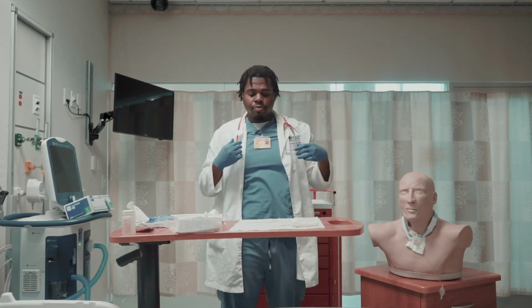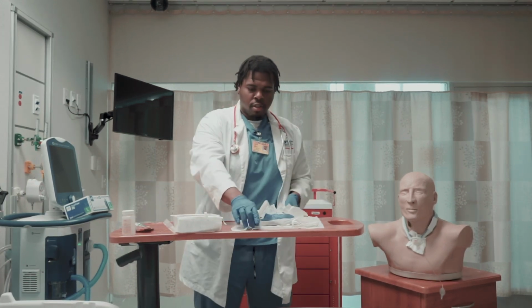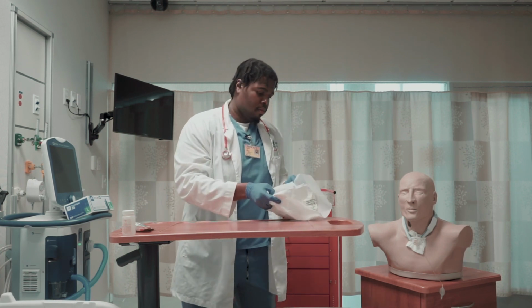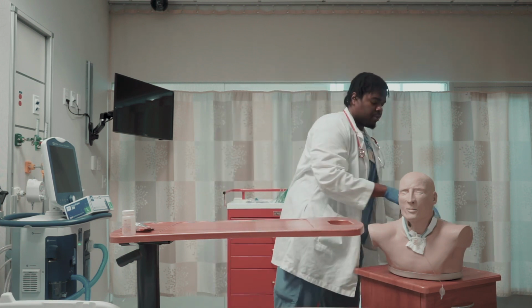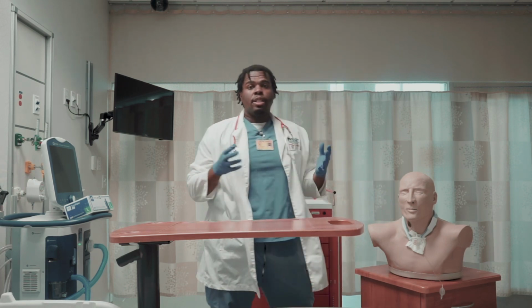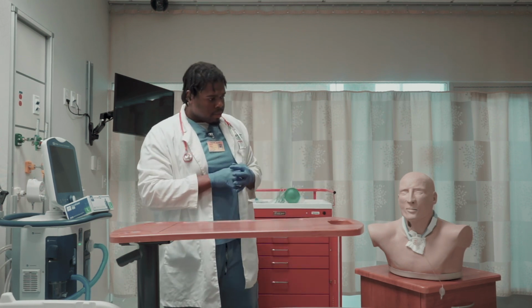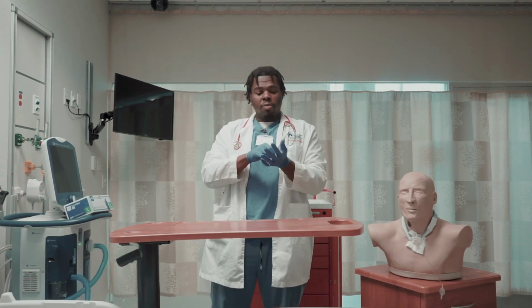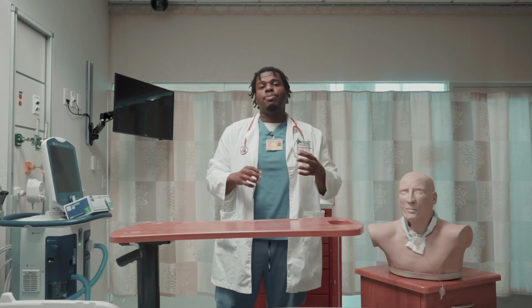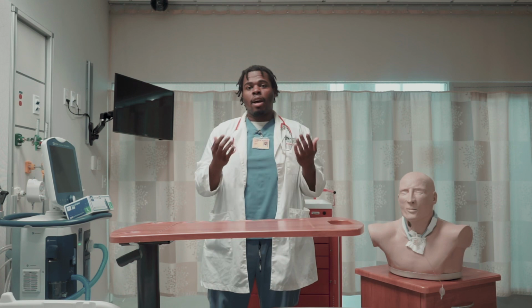Now that I've done that, I'm going to dispose of my cleaning utensils in the garbage. I'm going to ensure that the patient is comfortable. Do you need anything else? Okay. I'm going to remove my PPE, throw it in the garbage, wash my hands, and chart my findings and how the procedure went.